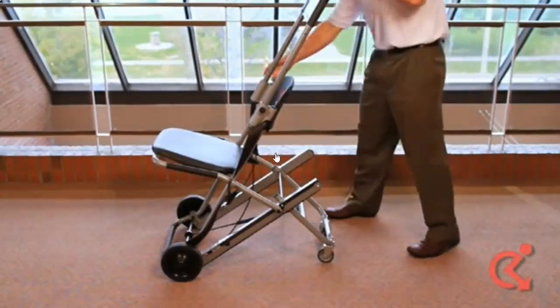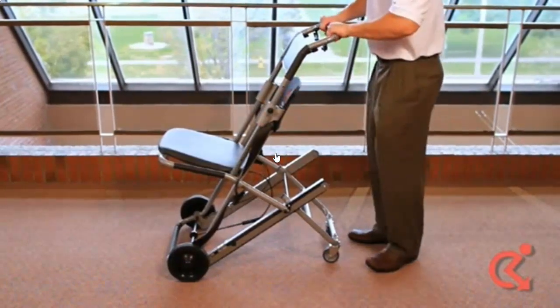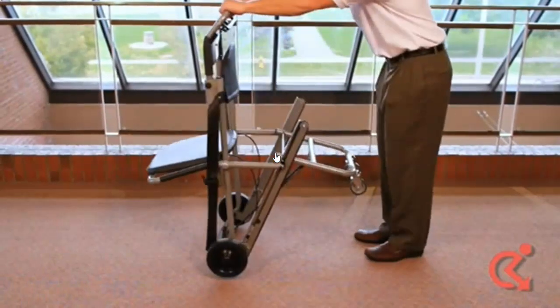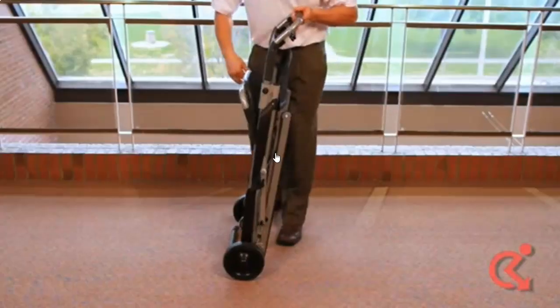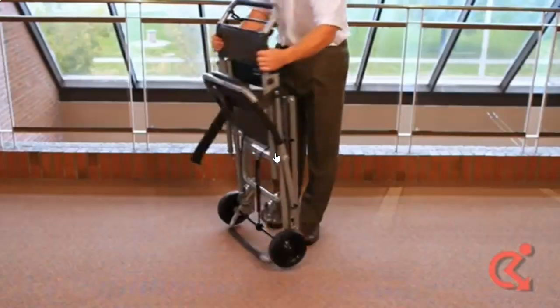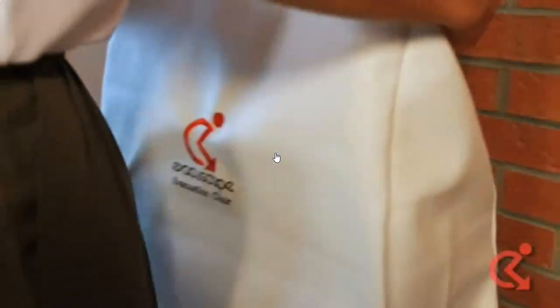To return the Evacuscape chair to its storage position, pull out the adjustable pins and push the handle down until it locks. Tilt the Evacuscape chair forward until it stops and push in the rear wheels. Lift up the seat to retract it and lock the seat belt. Place the Evacuscape chair on the wall bracket or in its storage position and replace the protective cover.